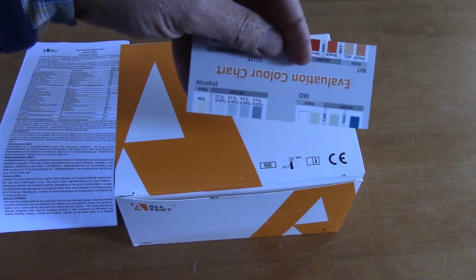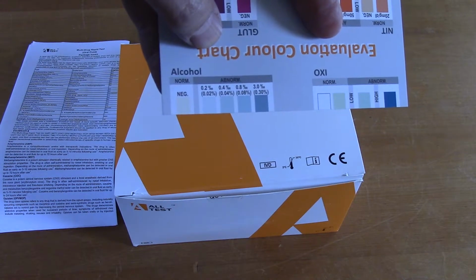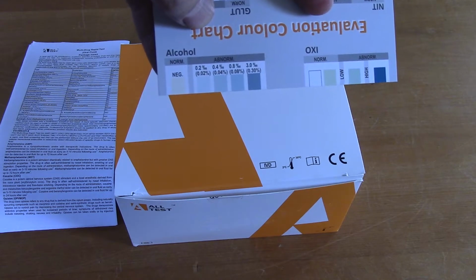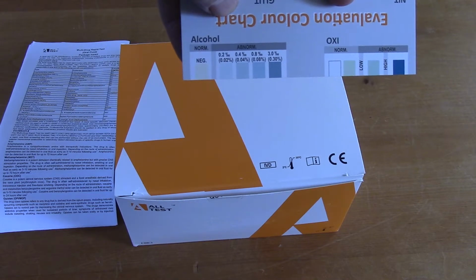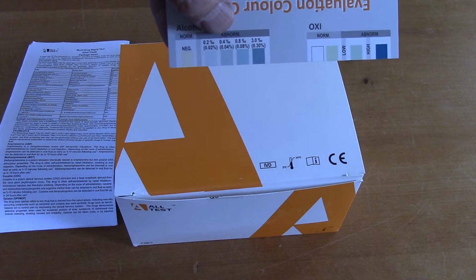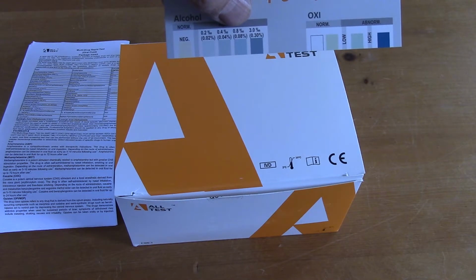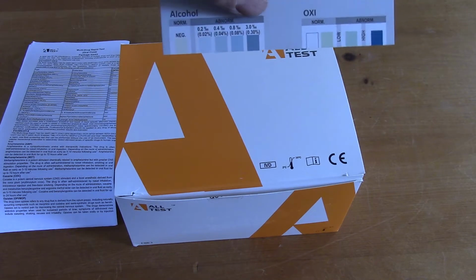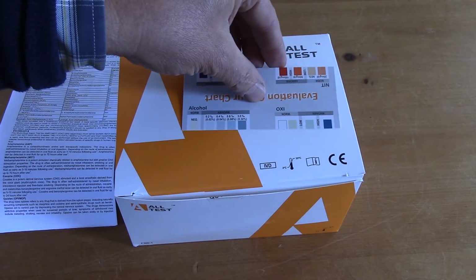The levels that you can expect to get on this, if we just show you this card, bring that in closer. I don't know whether that's focused, I can't see on this small screen I'm looking at. But you've got a negative indicator for no blood alcohol equivalent, and then it goes up in increments: 0.02, 0.04, 0.08, which is the drink driving limit for alcohol, and even higher than that, 0.3. So the alcohol doesn't look back in time.